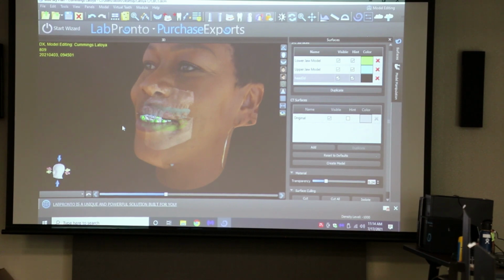We had to do the whole pre-printed cut, if you're happy with that. I think so, I mean, we're just trying to outline the inside of the mouth, right? Like if I were to be really picky, did you ever show it to her? That was kind of wow. No, I didn't, but I could, and that would have been great, but I did do that with that other guy that I was telling you about.